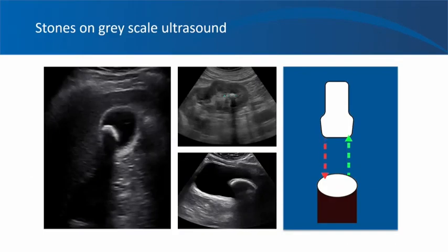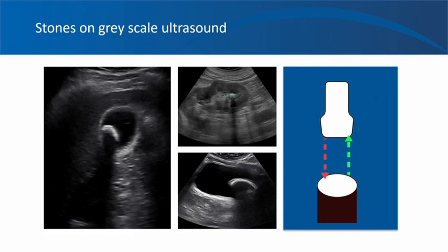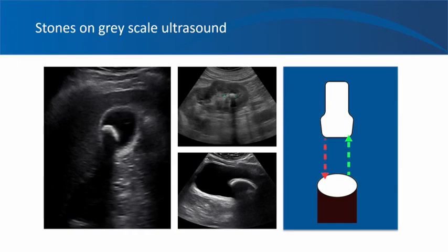How do stones appear on grayscale ultrasound? On grayscale imaging, stones appear as hyperechoic or bright structures accompanied by acoustic shadowing. Acoustic shadowing is the anechoic or black band seen beyond echogenic structures that do not transmit ultrasound waves, such as stone and bone or any calcified structure. It is similar to us forming a shadow when we are in the pathway of light.